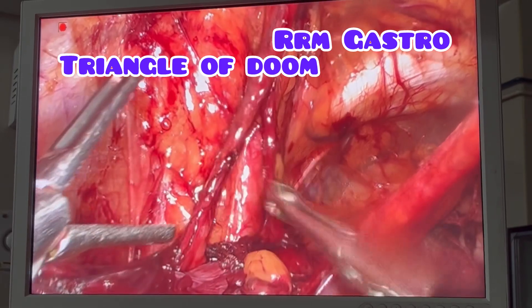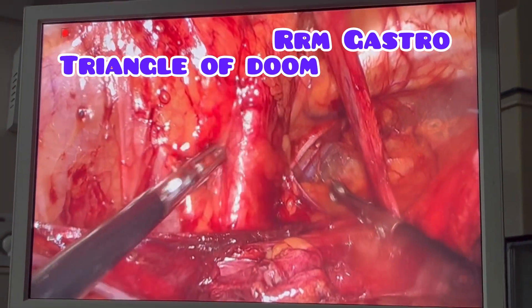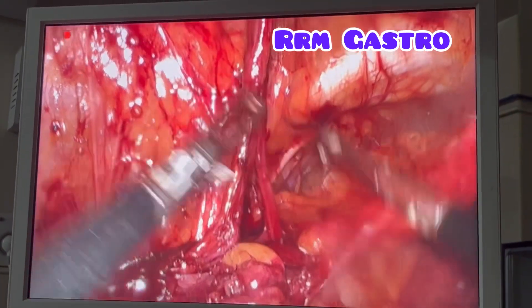This is a triangle of doom. Gonadal vessel, vas deferens, and peritoneum cause a triangle of doom. What I am now touching is the external iliac artery, and below that there will be external iliac vein.